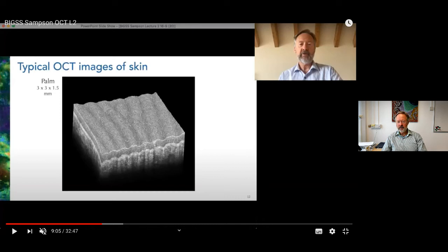Okay, Maria Pilar in Spain wants to know, regarding the previous question of light sources, can multiple lasers be used for OCT measurements? So using more than one laser at once. Yes, but it depends how you want to combine them. So if you want to combine them coherently, that's very challenging. So to get the true unambiguous resolution as if they were combined, they generally need to have some form of phase referencing between them. Now that type of technology exists for optical frequency combs, but is not widely available. It's quite challenging. If you want to incoherently combine them, then that can still be useful and is sometimes done.